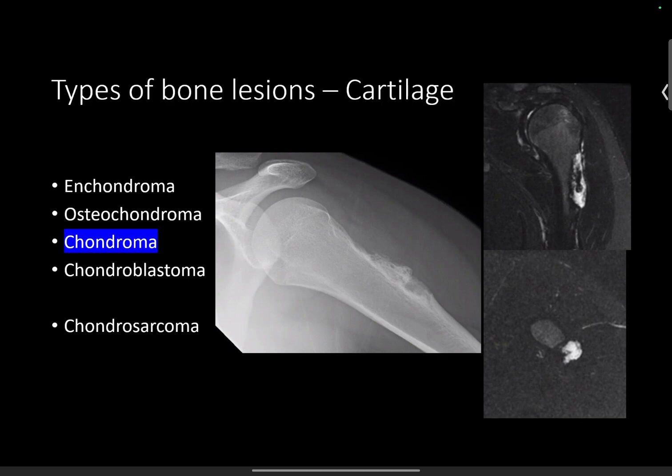Well, in the extremities and pelvis, I don't see hair on end. Right, I actually think it doesn't have that in my experience. Basically, it looks like a lucent lesion with internal fat sometimes, and it has that spoke wheel appearance of thick trabecular markings. I think what you may be referring to is sometimes in those calvarial hemangiomas, they can look kind of aggressive, if that's what you're referring to. But in long bones and pelvis, it doesn't have that type of reaction in my experience.